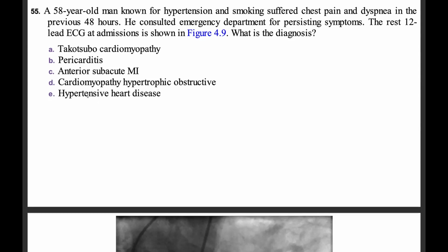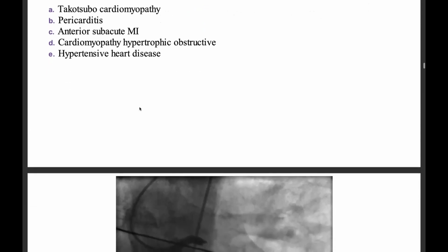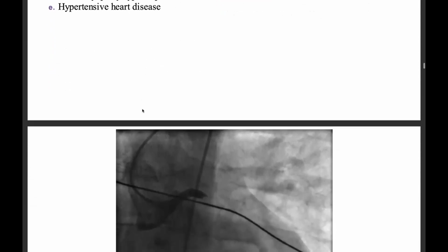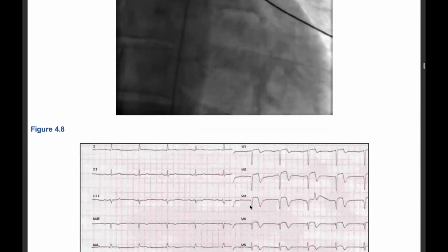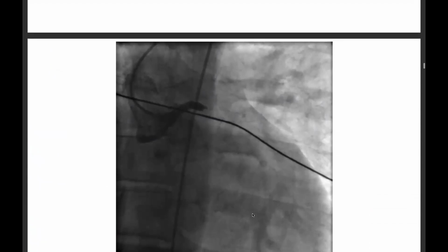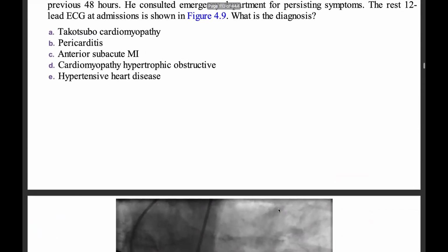cardiomyopathy as well. The cardiomyopathies may also have Q waves, all right, but those Q waves tend to be very narrow Q waves, especially for the apical cardiomyopathy. That's apical hypertrophic cardiomyopathy. They tend to have very narrow Q waves, like they have the Q waves, but they're narrow and sharp as well. So maybe in the context of Q waves, it may be a differential, but at least the voltages, we are not seeing very dominant QRS complexes here.